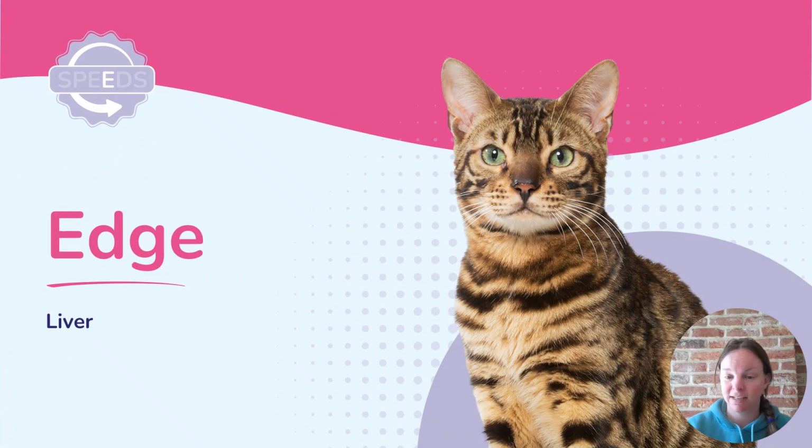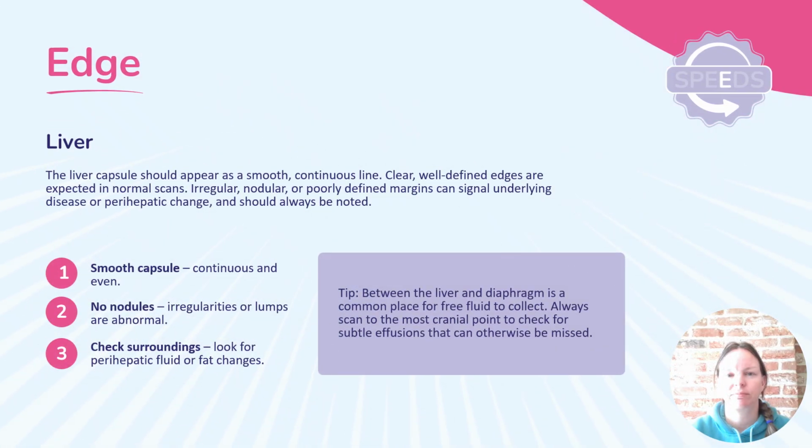Moving on to our second E, which is edge. So the edge of the liver should appear smooth, continuous, clear, well-defined edges are expected. If we've got any irregularities, any nodules, poorly defined margins, this could signal underlying disease or perihepatic changes and should always be noted. So we're expecting that smooth capsule, no nodules, and looking at the surroundings also.